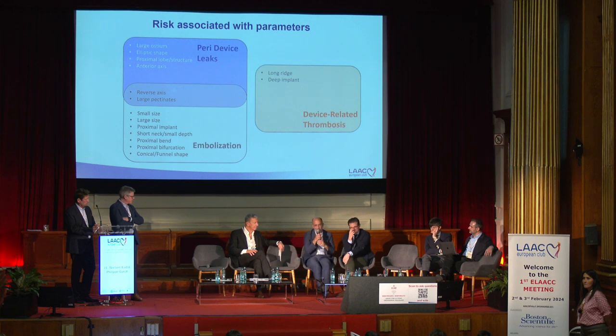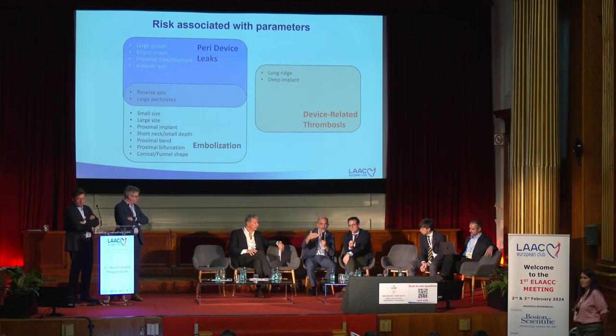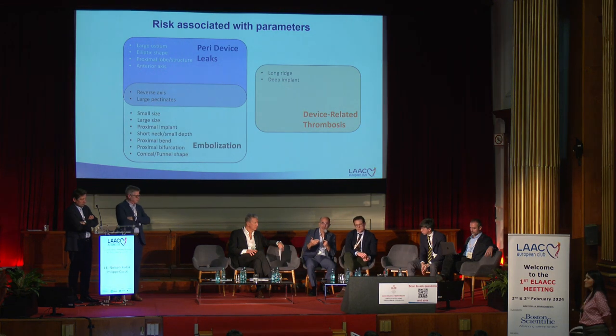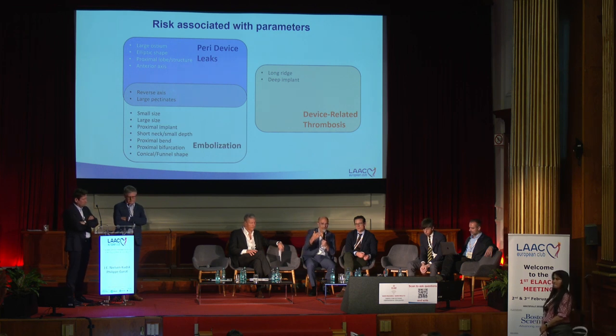Also, to answer our colleague from Israel, who said that it's for advanced operators, I think that if you start your program and your first two or three cases are super complex, based on this classification... for example, I have proctored cases where the first case was a reverse chicken wing and it was only discovered during the case. So if upfront you can anticipate that this will be the most complex case you will face as the first one, maybe you will delay this patient to another session and start with an easier case. So it can also give some insight for new implanters.